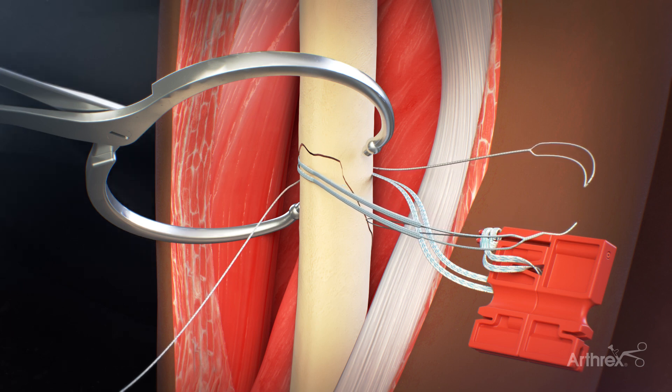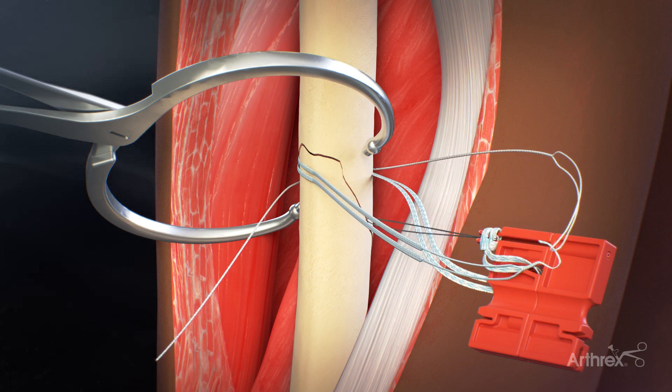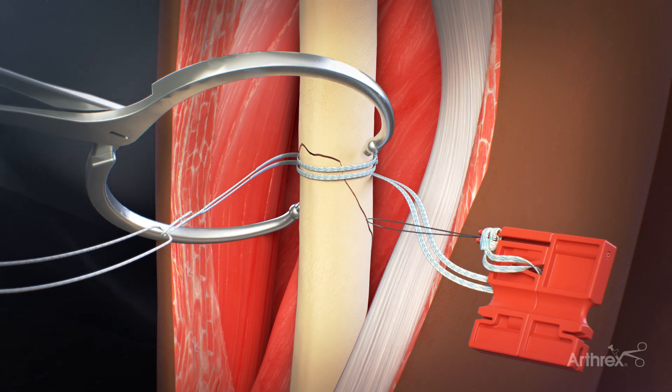Next, the tail of the fiber tape cerclage suture is loaded into the loop of the TigerLink. The tail of the TigerLink is then pulled to shuttle the fiber tape cerclage around the bone for a second pass.